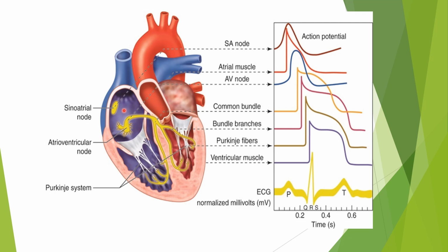If you are getting an electric shock, what is happening is that it will cause a contraction of the muscles. When the electric current passes through our body, it will cause the contraction of the muscles. In the same way, when the electrical impulses are generated from the SA node and transmitted to the myocardium, it will cause the contraction of the heart muscles. The cardiac impulses transmit through the heart and spread through the surrounding tissue and finally reach the skin of our body. This electric impulse in the skin is received by the electrodes of the ECG machine and is processed to produce an ECG.